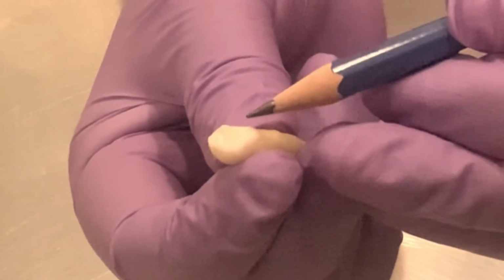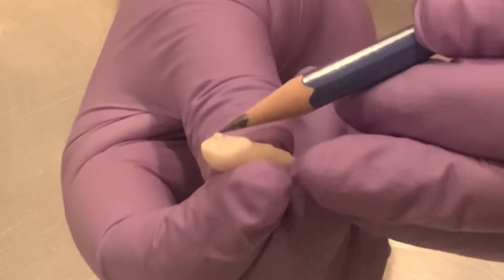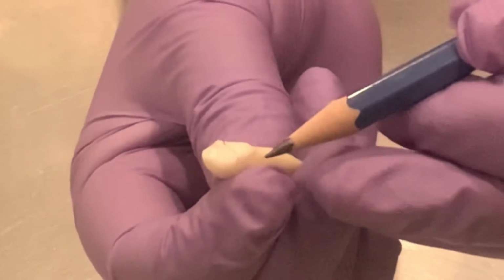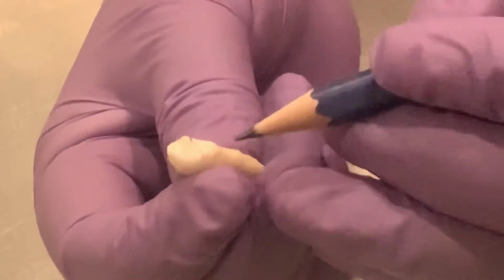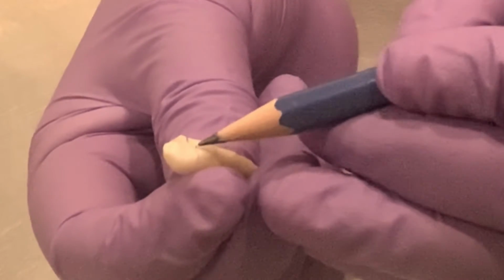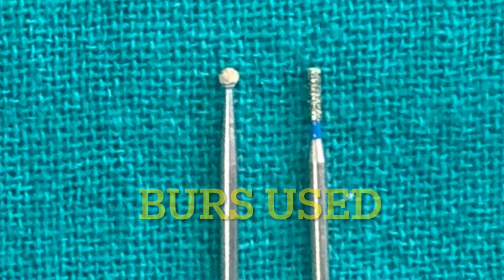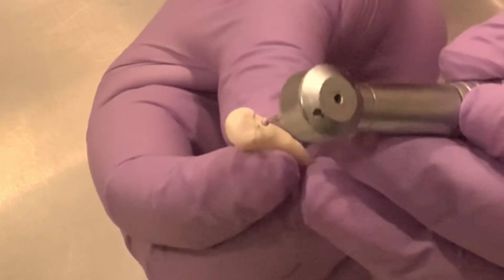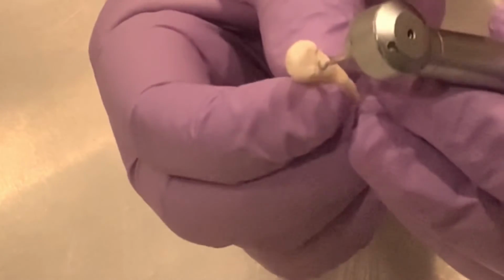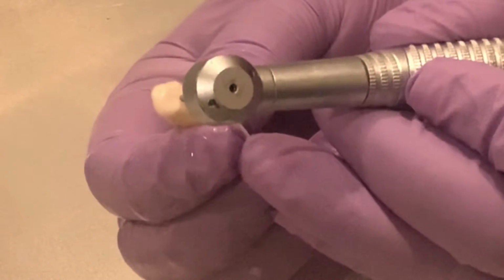To decide the point of entry, we divide the palatal surface into two parts by drawing a line like this. Now a point just below the mid-crown, somewhere here, is the point of initial entry for the access cavity. Position the round burr perpendicular to the palatal surface and start the initial cutting.